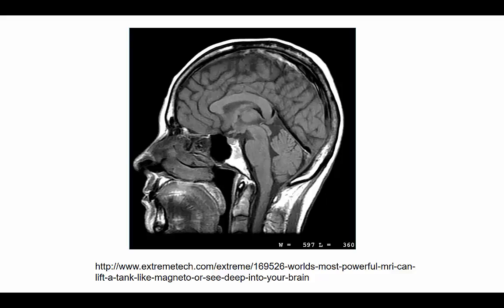In X-ray, if bone was the contrast agent, what is the contrast agent in MRI? It is hydrogen. Then, what is the most abundant source of hydrogen in our body? That should be water. So, most of the MRI images rely on water in the body. It's quite convenient. The different contrast in the image is due to the different environment of water molecules in the body.